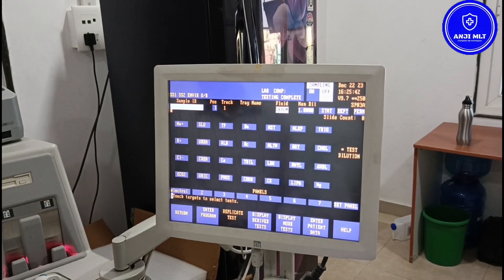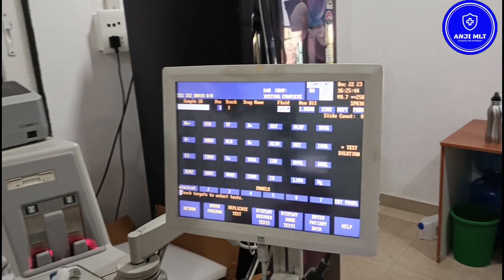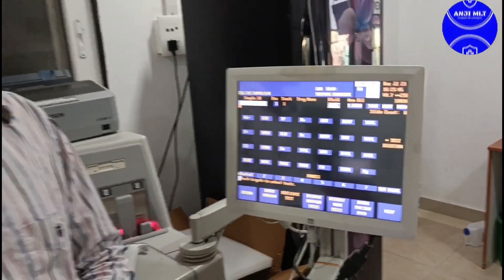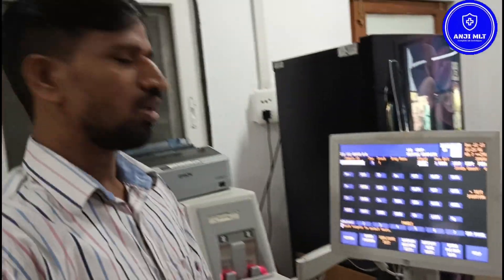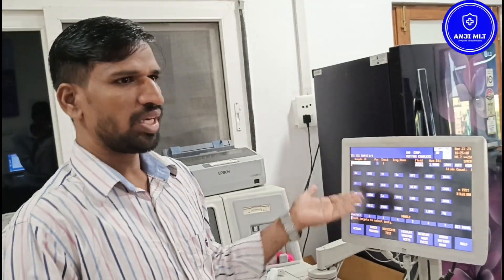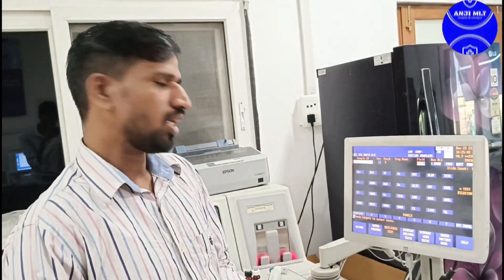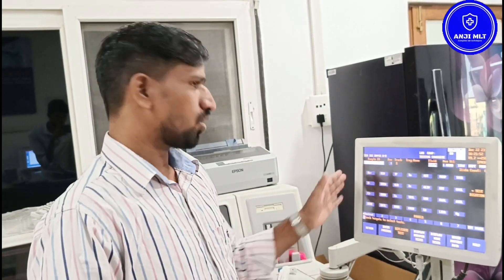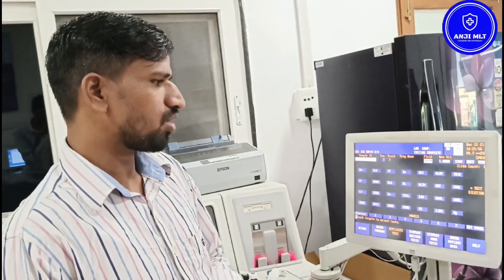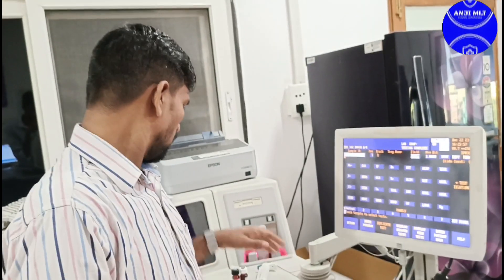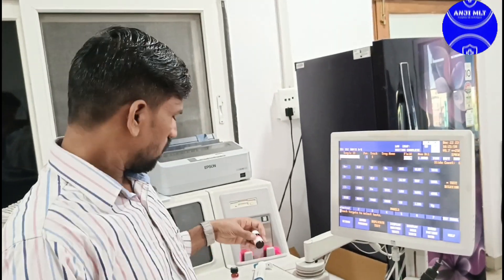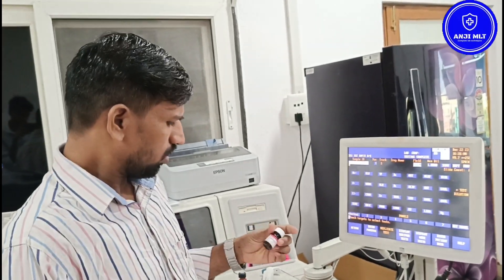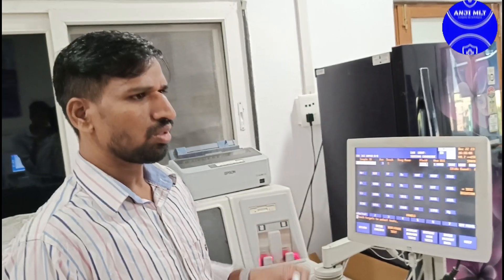I am going to check the patient sample. In the previous video, we had to check the patient name. So we check the patient name and then proceed.